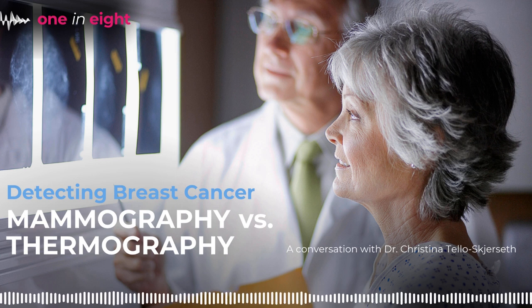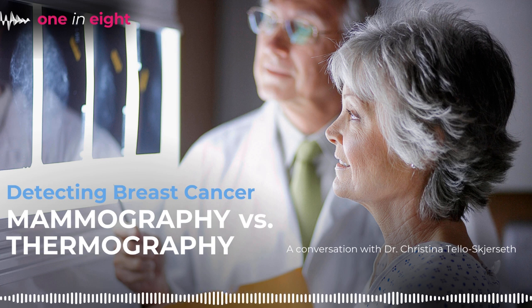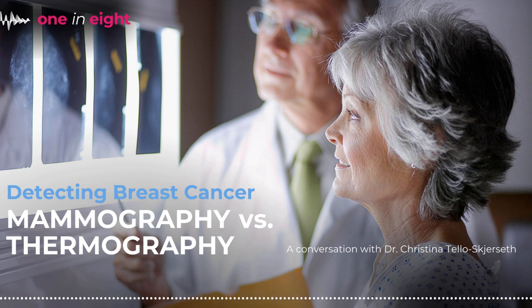What role, if any, does thermography play in breast cancer screening? To be honest, it really doesn't play a role in screening. I think some people just feel better with getting some kind of exam that is pain-free and doesn't have radiation. And that's fine for some people, but you need to know that it's not actually detecting cancer. And just because you get a negative thermogram does not mean you don't have cancer. You really should be using a modality like mammography, which has all the data behind it, and that's federally regulated so that things are done consistently and accurately.